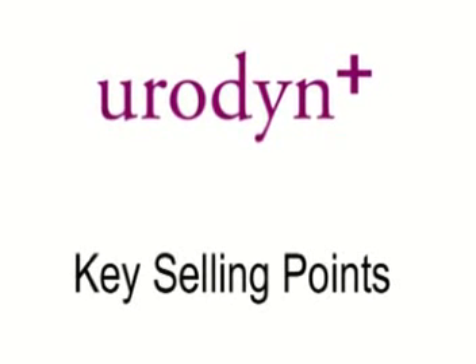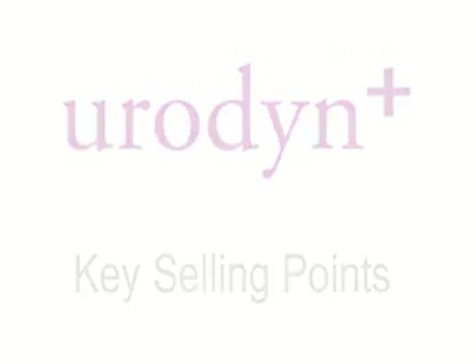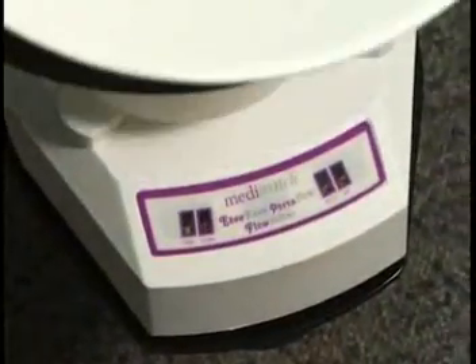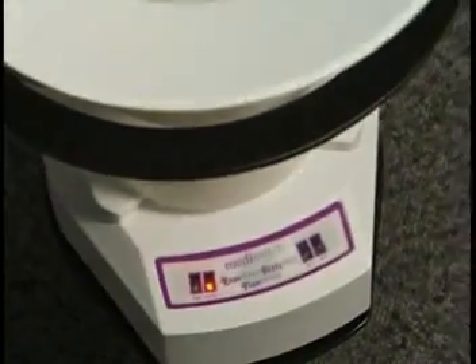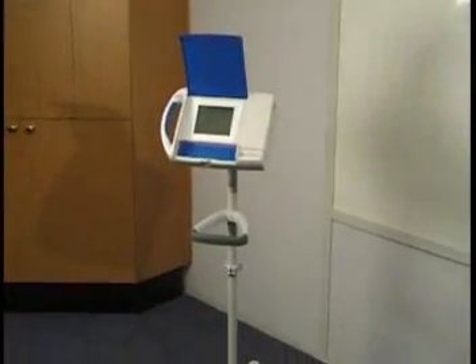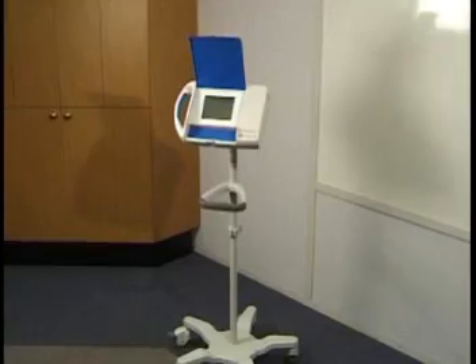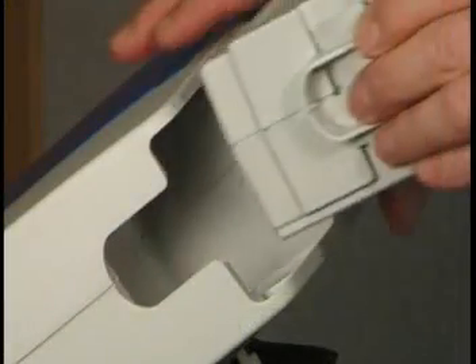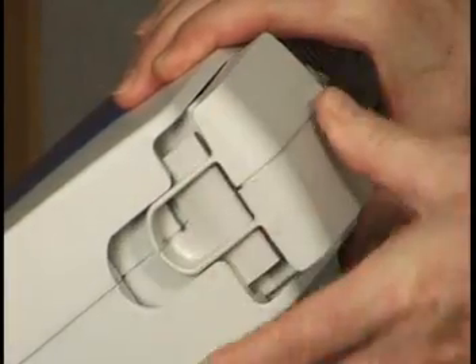Key selling points for Eurodyne Plus are wireless connection to its flow meters, which can be either a wireless spinning disc flow meter or a wireless weight cell flow meter. Eurodyne Plus can be placed in a wall mount, on the table, or on a lightweight floor stand — no wires required.